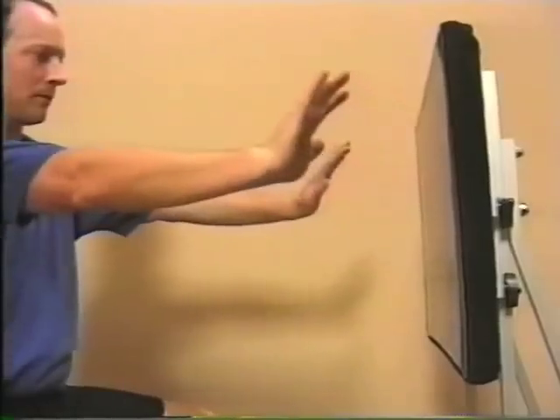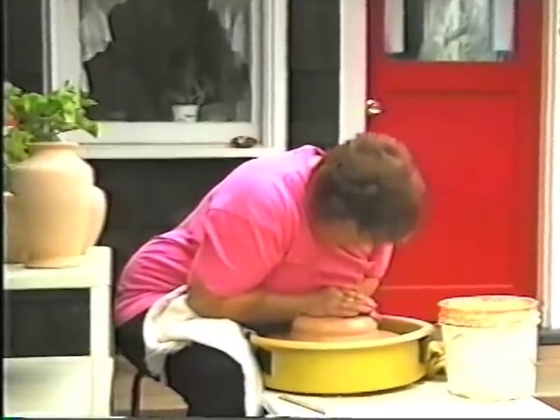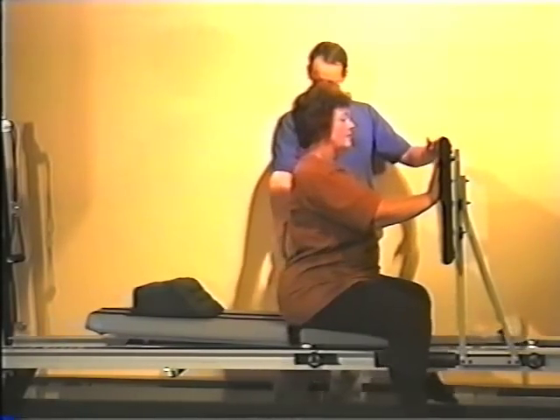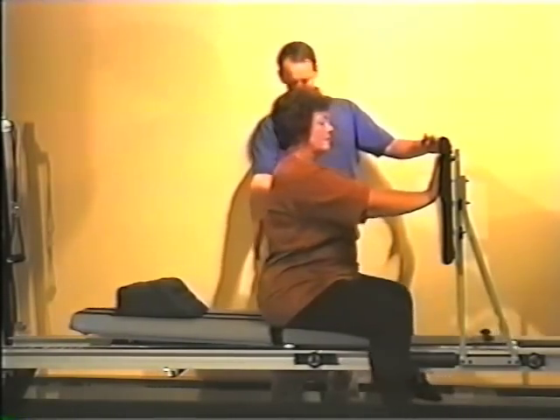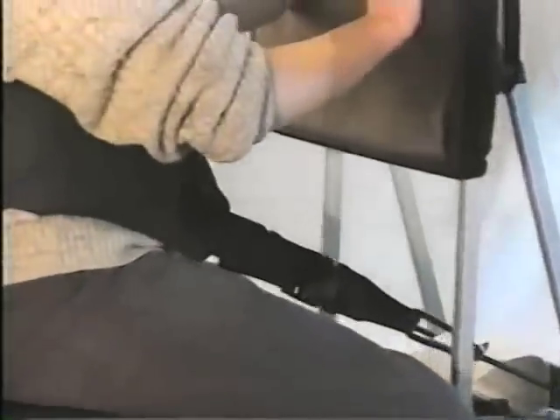You can also perform upper body activities using the kick plate. Back patients will also benefit from upper body exercises on the shuttle because the horizontal movement demands that the patient stabilize themselves. However, for patients who don't have sufficient strength to perform these activities unsupported, we offer the back support belt.